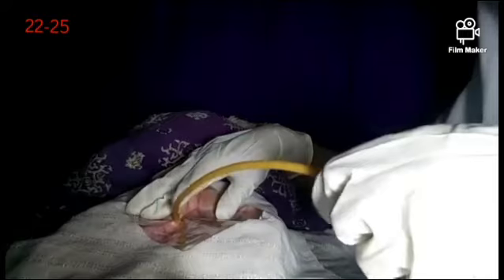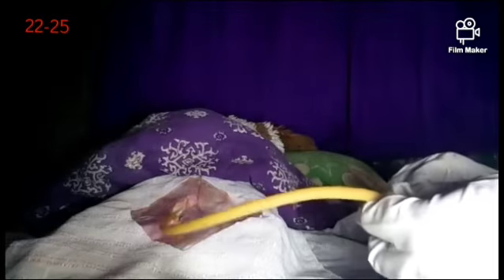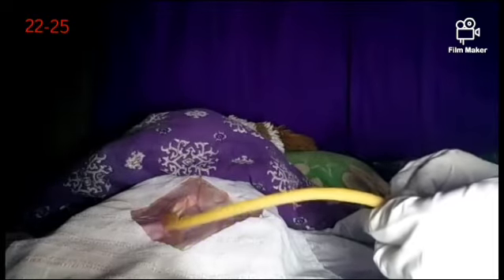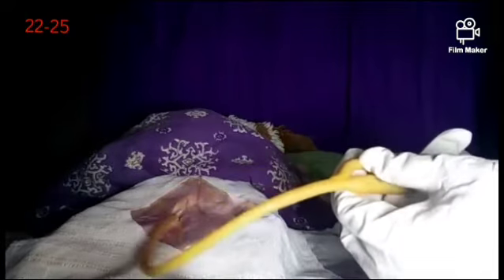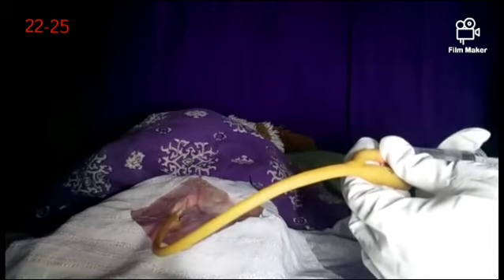Remove the catheter smoothly and slowly if you use a straight catheter. If a Foley catheter is used, introduce 5 cc of sterile water or distilled water. To secure the catheter, gently pull the catheter until the retention balloon is snuggled against the bladder neck, so resistance will be met.